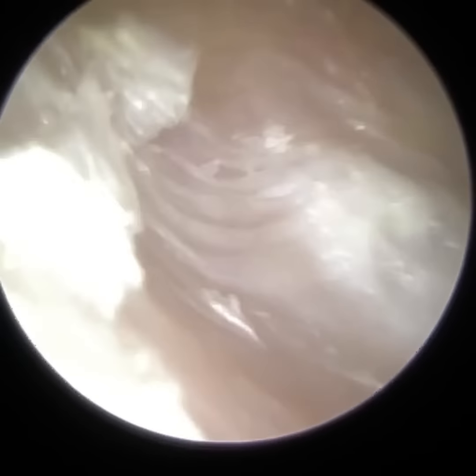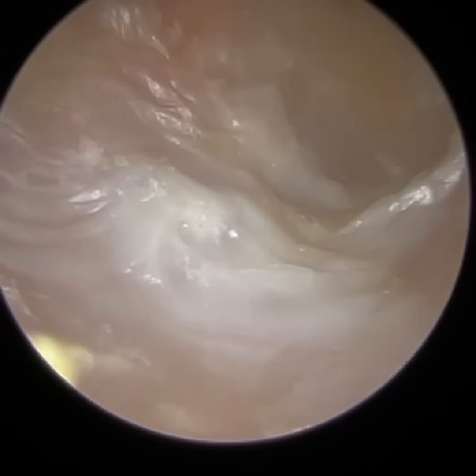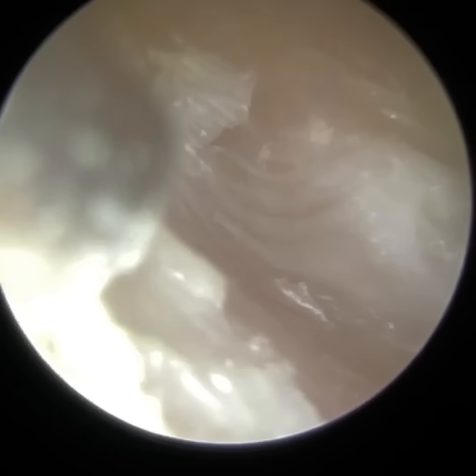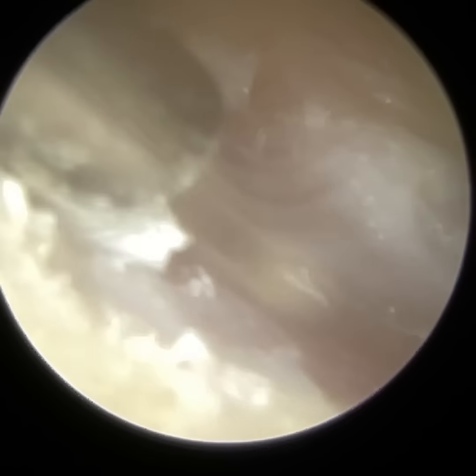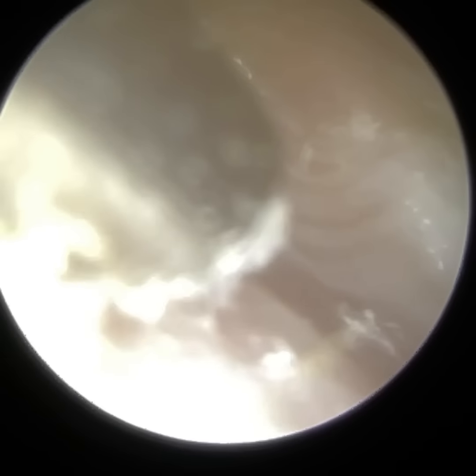So you can see this section of the ear canal is probably a bit wider than the rest. So now it could be just years of this chronic otitis externa, and it's not eroding the canal wall. So there's no ulceration, the epithelial skin is still intact underneath this dead skin. So it's not a canal cholesteatoma, but there is some sort of widening. So it could be because this patient has chronic skin plugs.